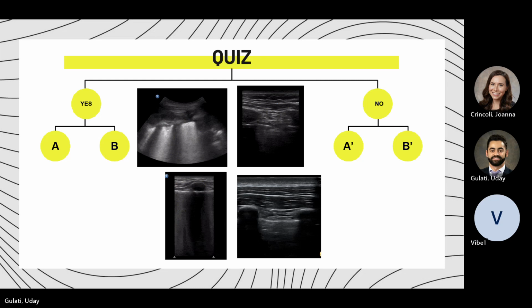No, so okay, now let's do the M mode right here, right? Here's your screen. Here's your rib space, and you've put the M mode through a region, right? So now you put the M mode through here, okay? If I just see lines going like this, you guys see my arrow moving? If I just see straight lines like a barcode, that means that from here all the way down, I'm not seeing any motion. Yep, we don't see what you're drawing. Oh, stop. Okay, for some reason. Okay, so if I just see this, we see it again now.